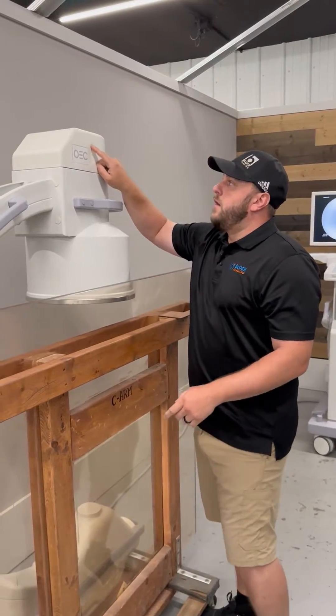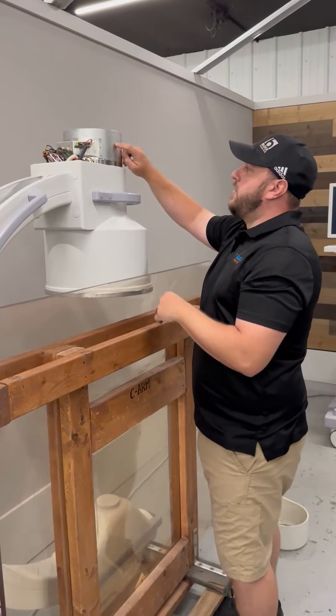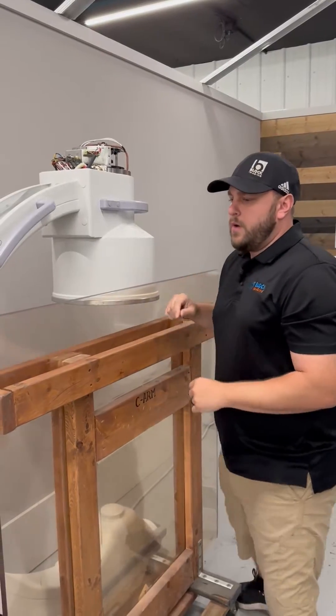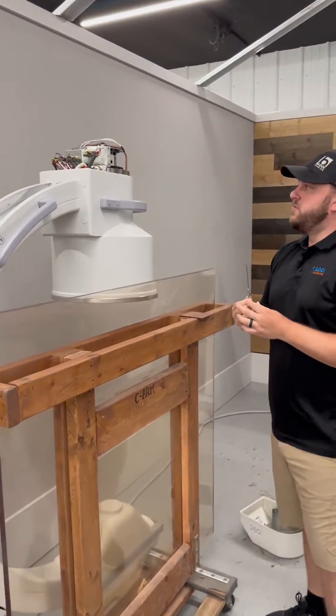For time purposes I've already removed the screws. We'll remove our cam cover as well to get access to our camera.